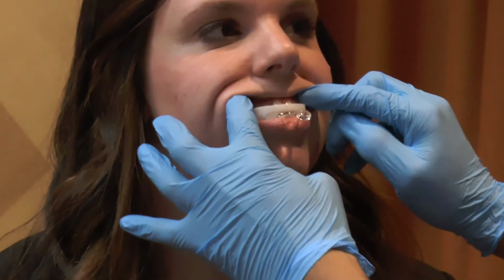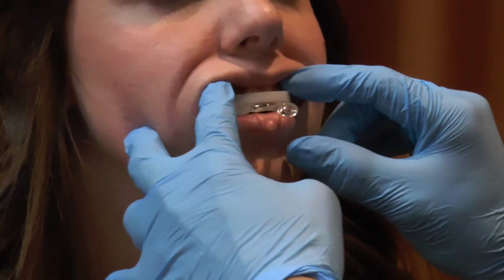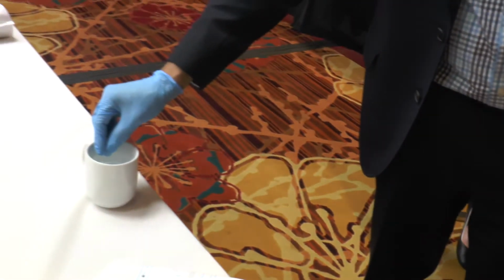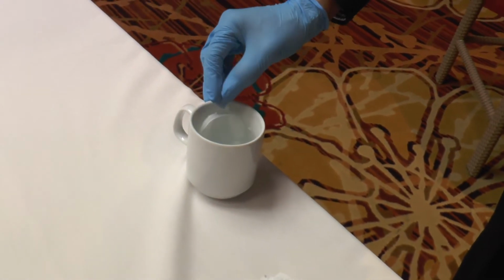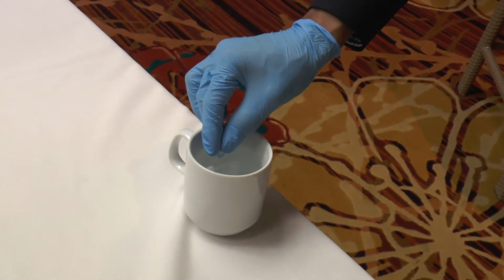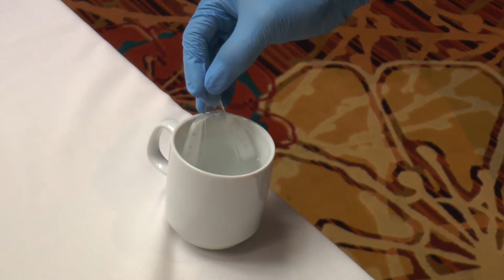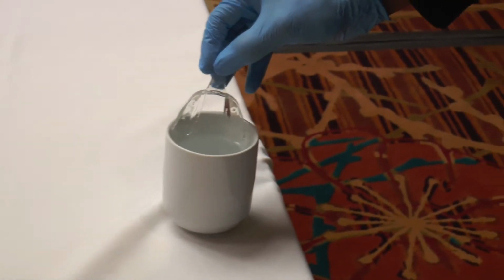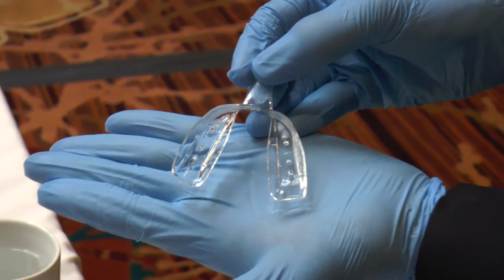So let's go ahead and close in for a second. What we're going to take a peek at is to make sure, which it does, that it covers all the teeth adequately. So our next step would be to get some warm water, and we are going to place it in the water and have it soften up. You'll know this will occur when the white material turns to clear. The hotter the water, the better the outcome. As you can see, it's starting to change color. Okay, so how you know it's ready, you'll see that the material has changed from white to clear.